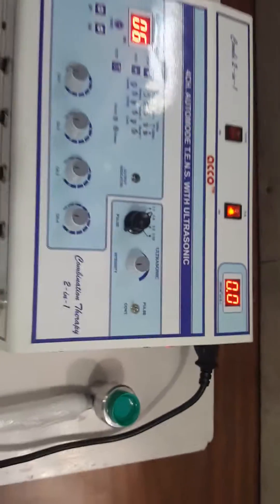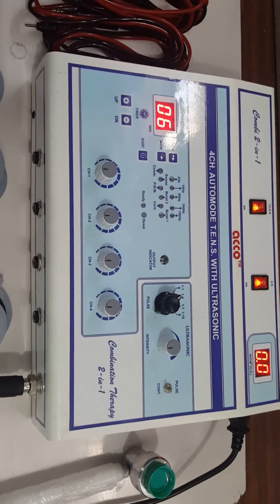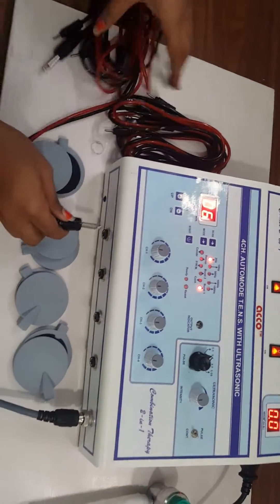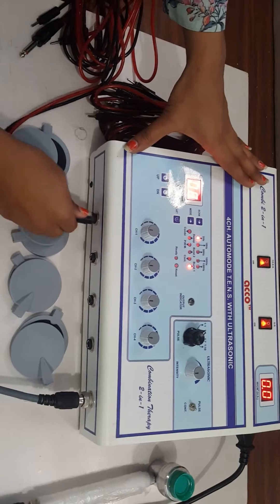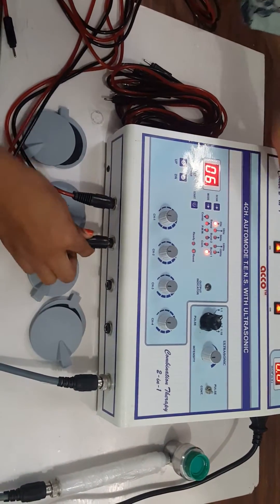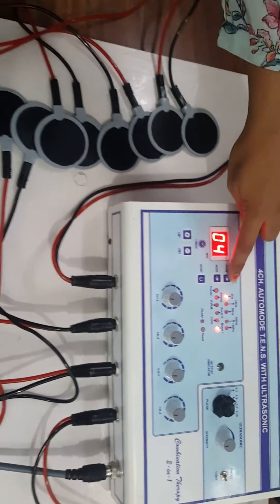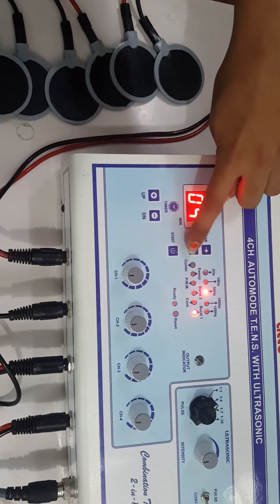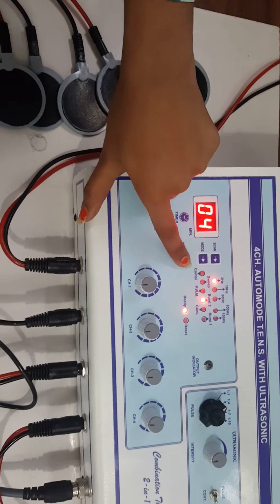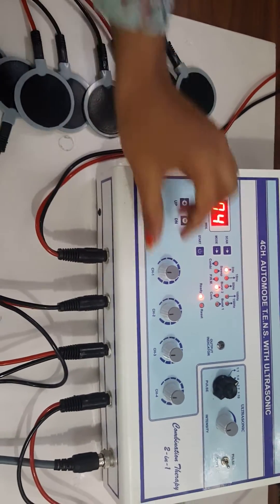Now we will show you the demo of the TENS unit 4-channel auto mode. Switch on the TENS unit, attach the wire and pads. Set the frequency as per your need, set the mode as per unit, then press the start button and increase the intensity as per unit.